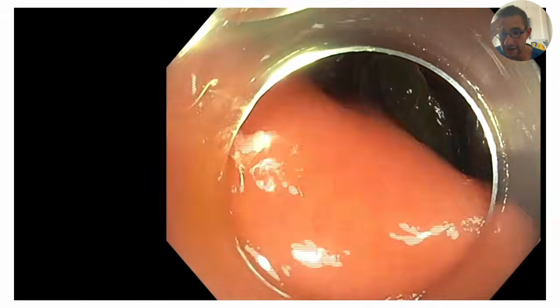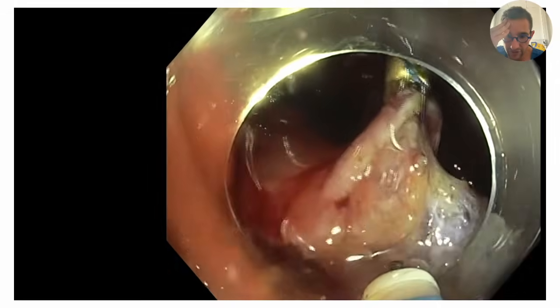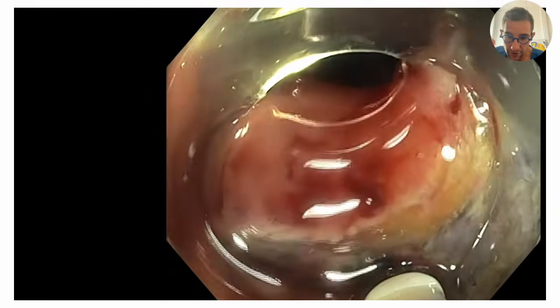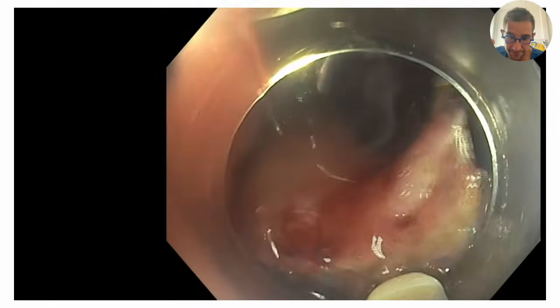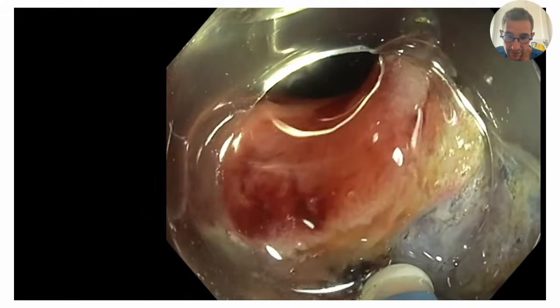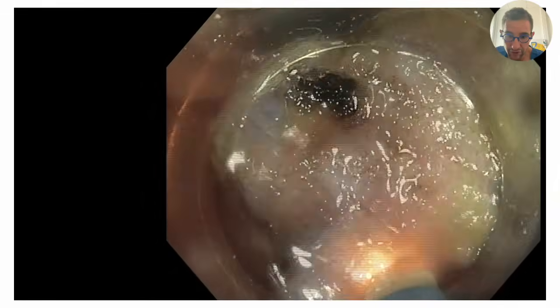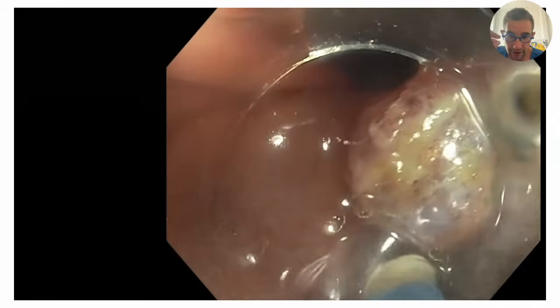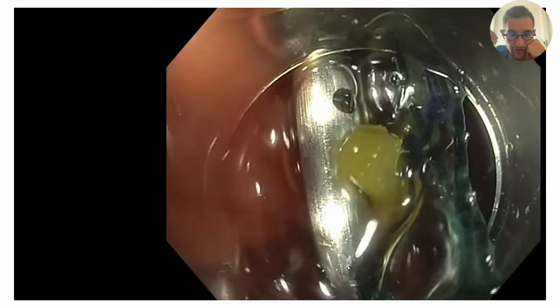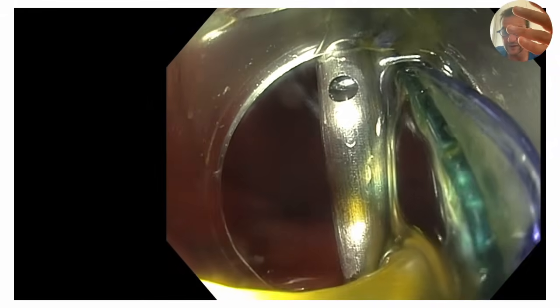It means at the beginning to enter the good layer, and you can see here that the yellowish fibrosis is shallow, but at the depth we have a blue layer which is under the fibrotic area, and that is not so large, but it's possible to inject it and to cut it thanks to the exposure of the traction. So yes, you should be very careful because the space is small and the risk of touching the muscle is important because the muscle goes with the specimen because of the traction.